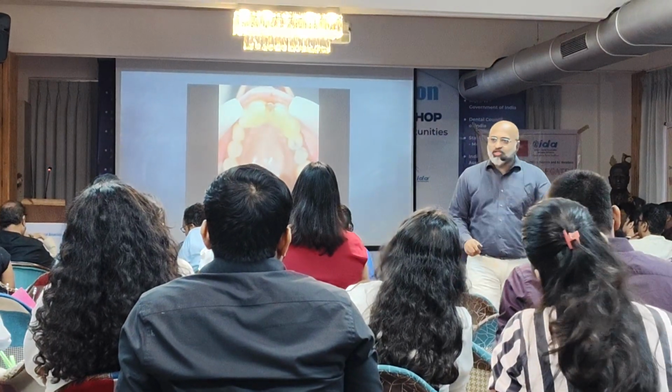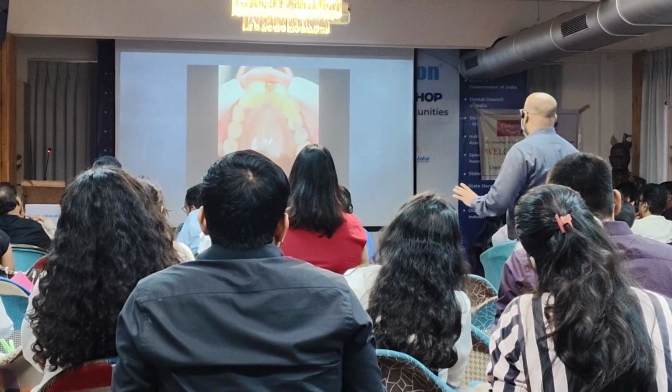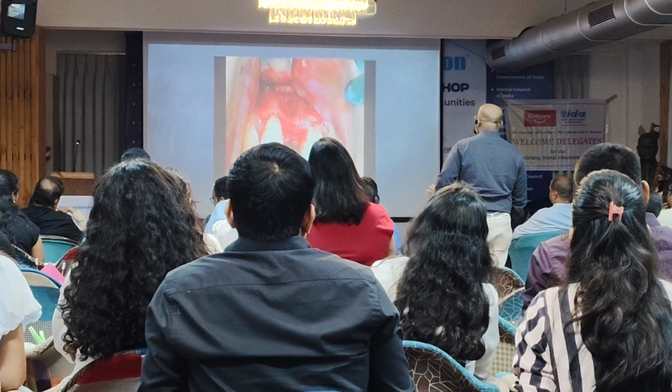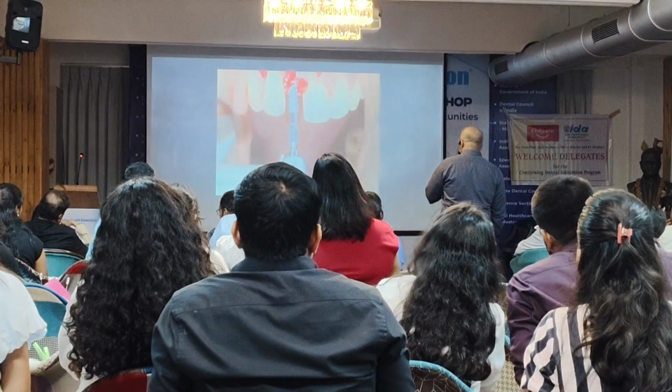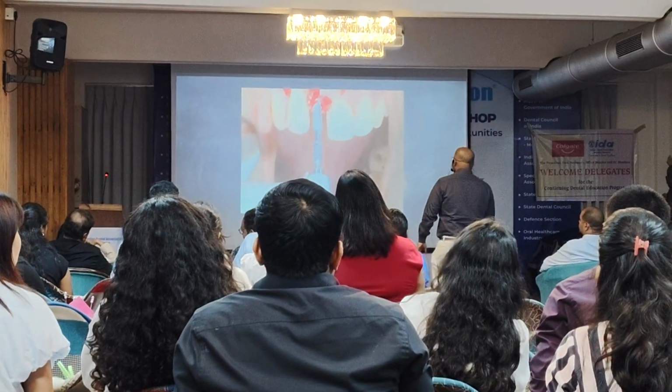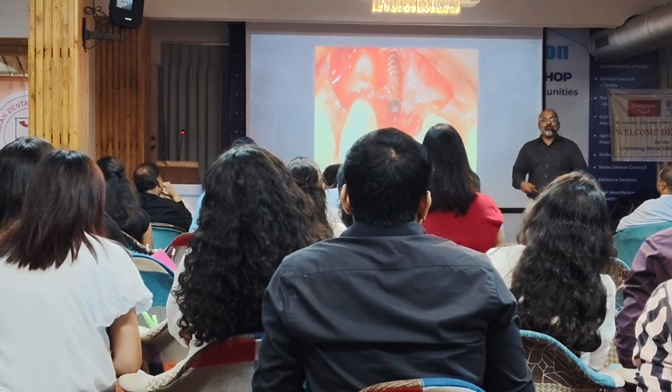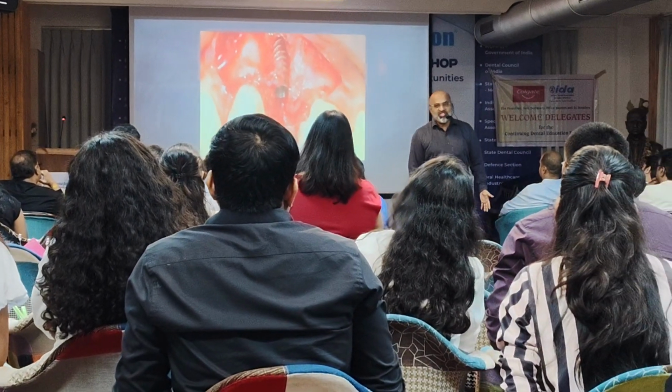which orients my implant prosthetic. That's it. This is where my implant position was. Place the implant. Now I do something called guided bone regeneration, GBR.